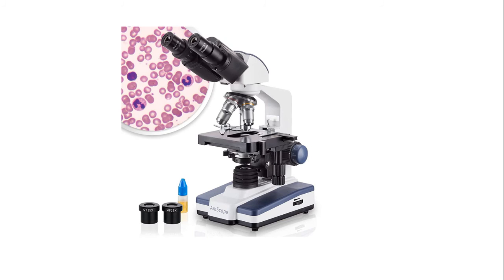We prepare the slide and look at it under the microscope. In the microscope, we see the structure of the cells. Normal cells and cancerous cells are different. In a cancerous cell, the nucleus is very large and the nucleocytoplasmic ratio is disturbed. So we differentiate the normal cell and the cancerous cell. There is a special pathologist called an oncopathologist, who diagnoses whether the cell is normal or abnormal.